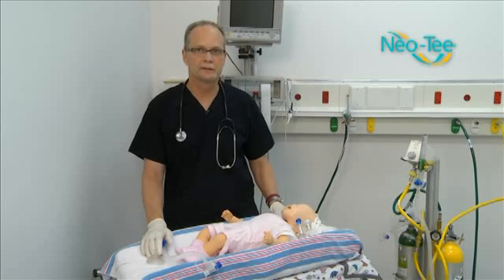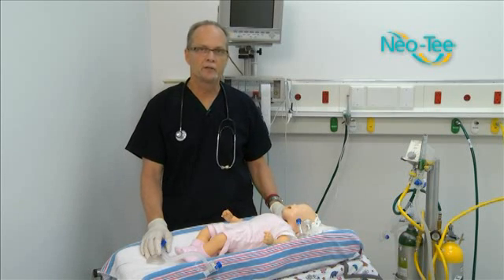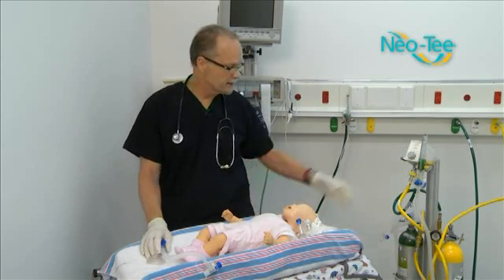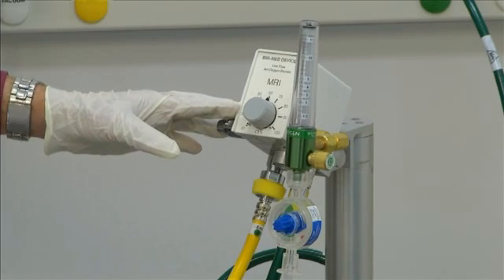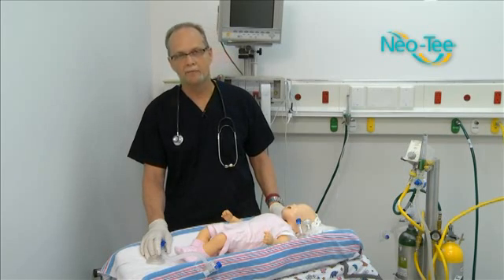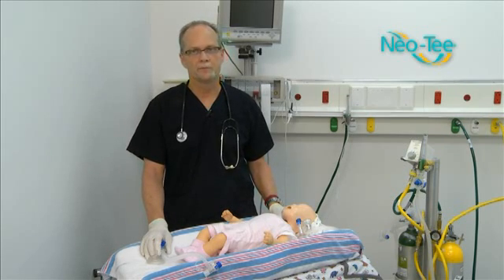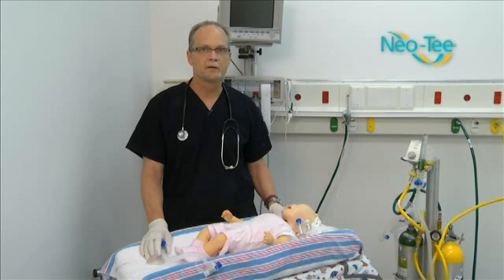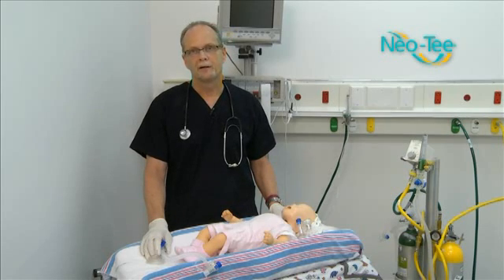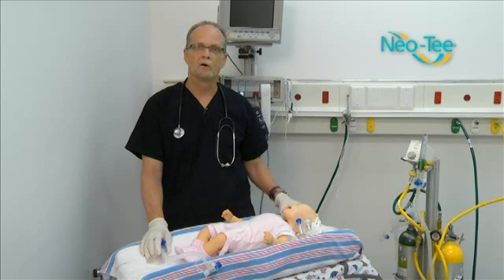According to the neonatal resuscitation protocols, it's always a good idea when you're ventilating a patient of this age and size to use a blender. The same protocols talk about using a T-Piece Resuscitator over a bag valve mask or a high-flow mask, because you get more consistent pressure and more consistent volumes. It also cuts down on the fatigue of the rescuer, because it's a very tiring thing to do if you have to do it for a long time.